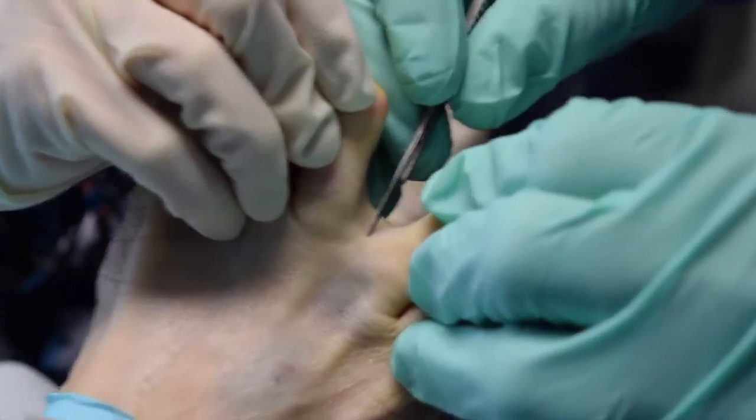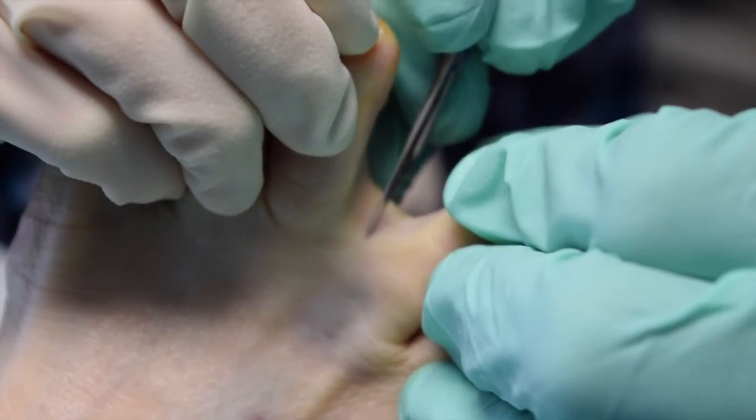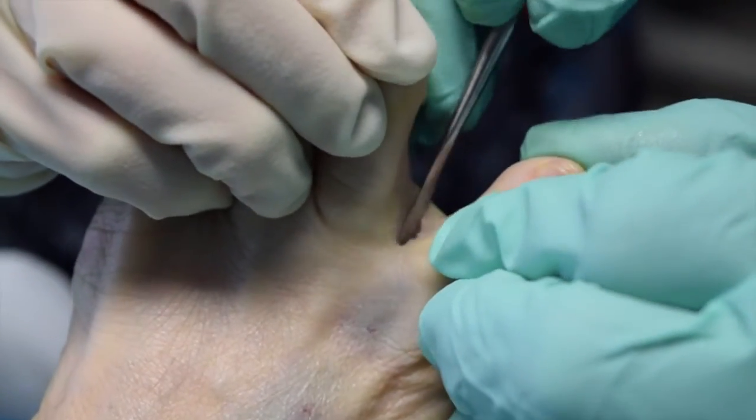We're going to show you a minimally invasive decompression of a neuroma. We start this by a small incision interdigitally, and this is done very lightly, making sure you don't injure any veins or superficial nerves.